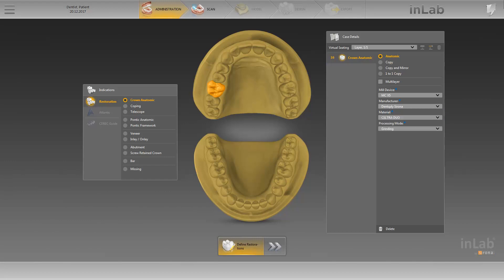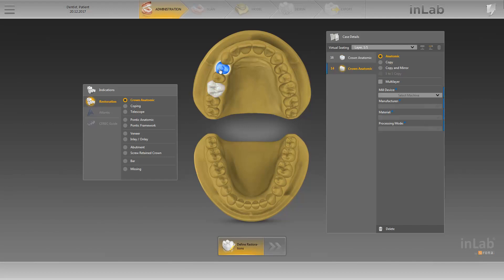Once all fields marked in blue have been completed, you can switch to the next phase, the scan phase, by clicking on the double arrow. As we also want to show you how to create multiple single tooth restorations, we'll stay in the administration phase and specify further restorations in the odontogram. As soon as you add an item, it appears immediately highlighted in orange in the odontogram and under Case Details in the window on the right.